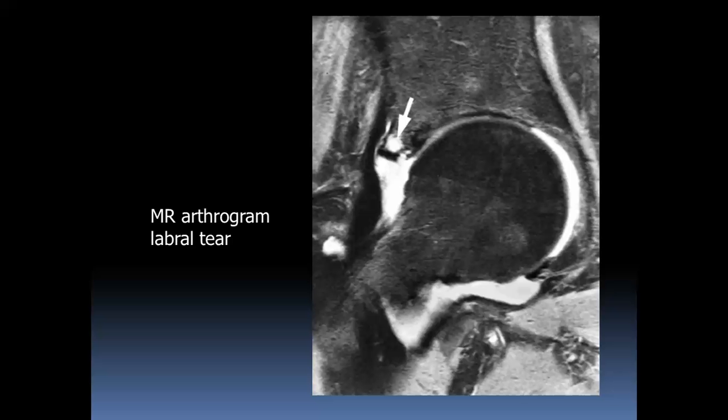Beforehand, we were using MRI arthrography for visualization of the labrum tear. MRI can show this without injection.